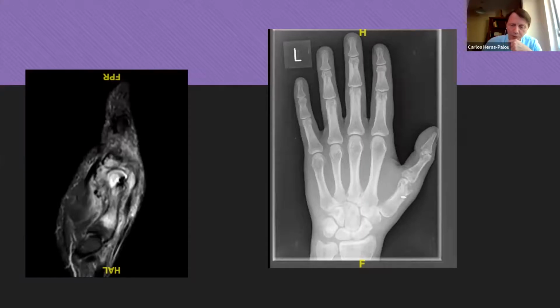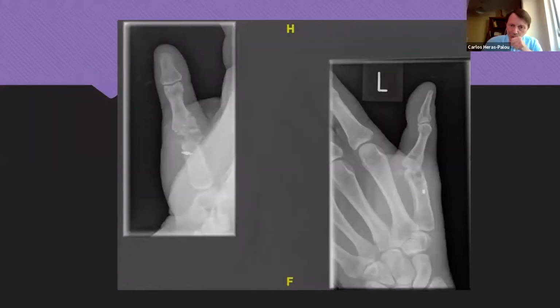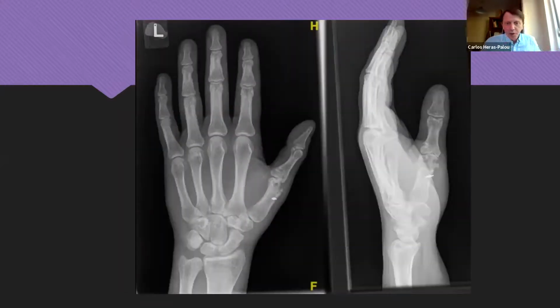Any movement was very painful. So, that's what it looked like when I saw him. And he couldn't use this thumb at all, which was very disabling actually. So I thought we would fuse that once I was sure that the infection had settled. And you could argue with this, but I tend to do my MCP arthrodesis the same that I do the PIPs, with a tension band wire.